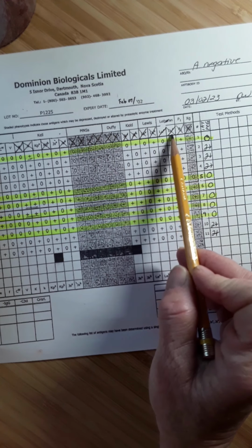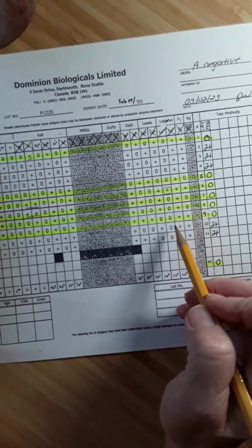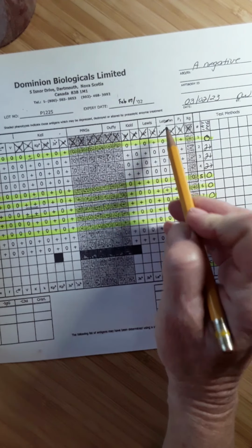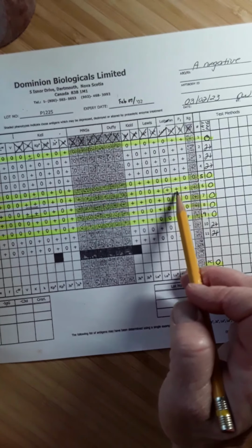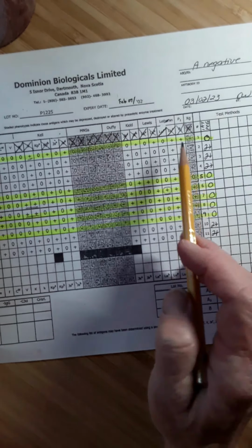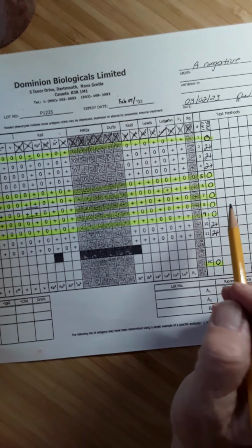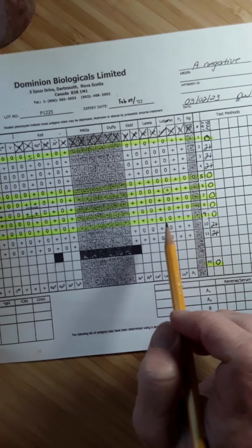For Lutheran A, I was only able to find one Lutheran A positive cell that did not react, so I only have one slash for that. Lutheran B, I was able to find many positive cells that did not react, so it's crossed out. P1 is crossed out and XGA is crossed out. They stand on their own. So that's what I'm left with.